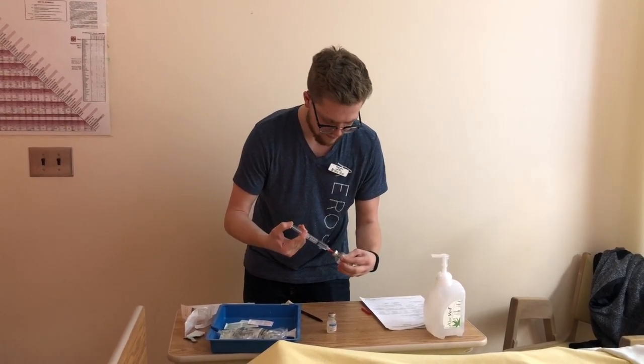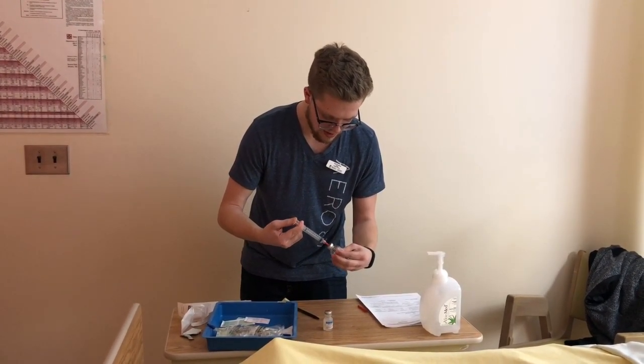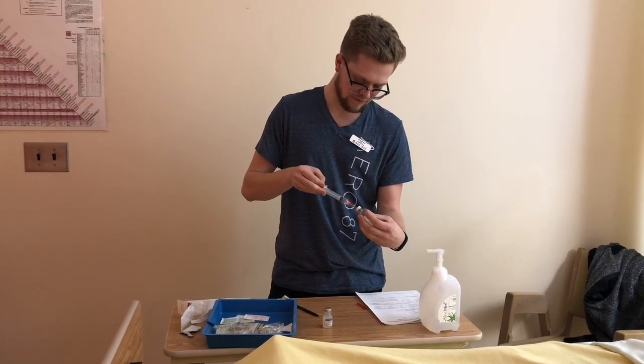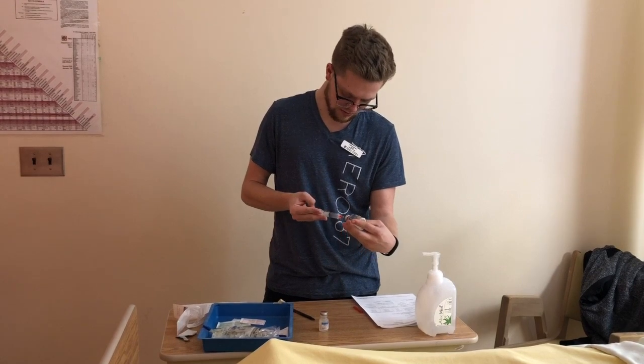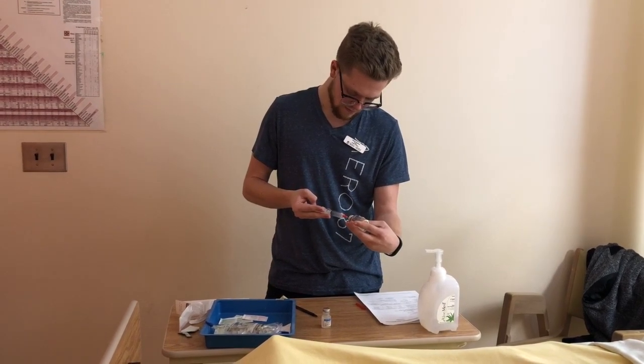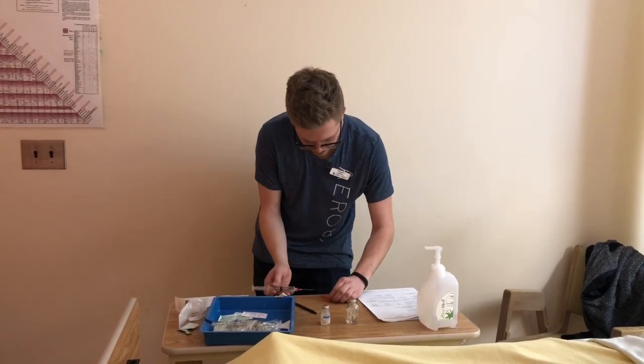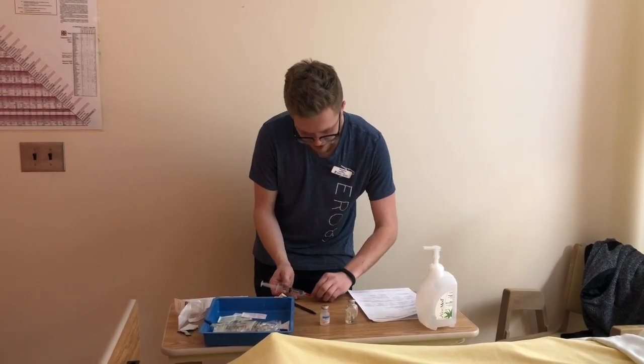And then we're going to let that air come out as well. We're going to want about 6.8 mLs of air after, to get rid of the pressure. All right, good. And now I'm going to recap this for sterility, and then we will reconstitute the medication.